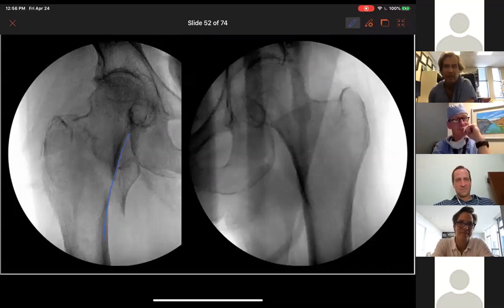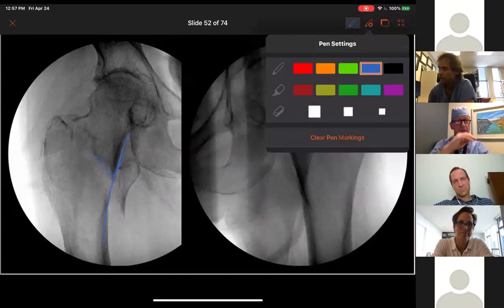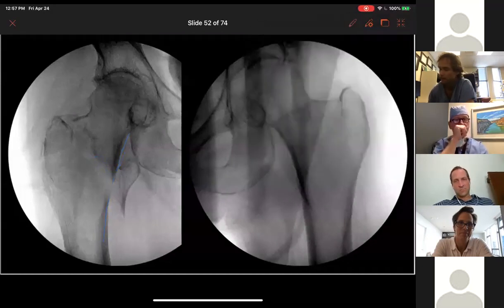So you're trying to feel over the anteromedial side of this fracture to see if you can key in this spike here. Is that fair? It'd be that posterior medial spike, which you wouldn't normally go anterior for because it's counterintuitive. Sometimes you can get to it by coming over the top. Because you can't just keep pulling and twisting. You've got to get control. It's kind of like a femoral neck. You almost got to get control of both segments before you think you're going to get a reduction. You almost got to make them independent. So get the shaft or whatever's left of the shaft away from the neck, put the neck where it should be, and then put the shaft where it should be.